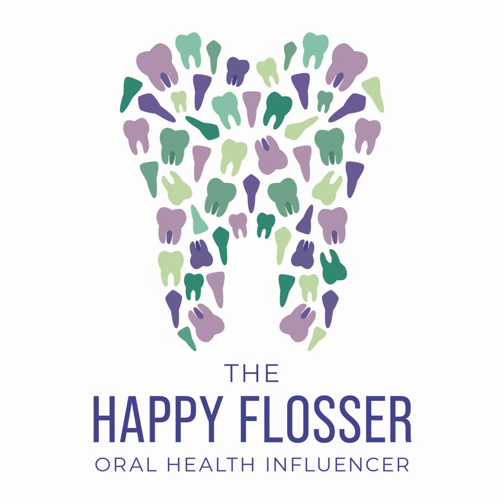When you are doing the mandibular premolar position, you are going to position the central ray at the embrasure space between the second premolar and the first molar. Again, you are positioning the sensor in a horizontal orientation and you are using the yellow posterior rim. You're going to seat the sensor on the floor of the mouth, not on the patient's tongue. Try to get the distal of the canine, which is not always possible depending on the shape of the patient's mouth, or if there's mandibular tori present. These present some challenges for you.